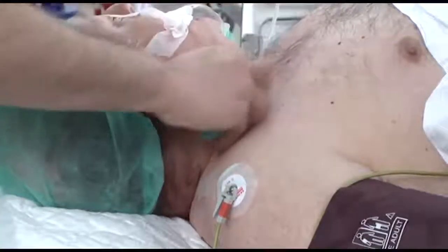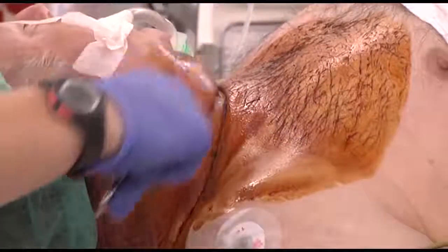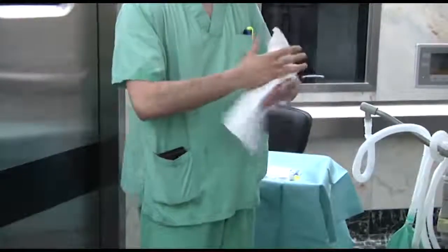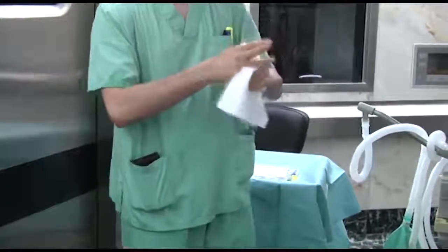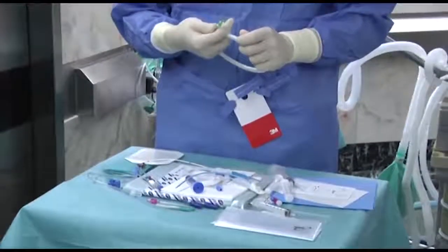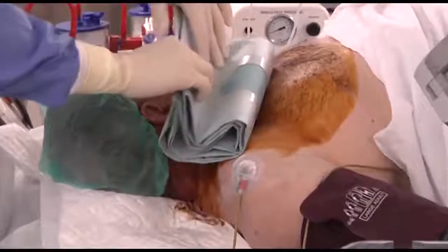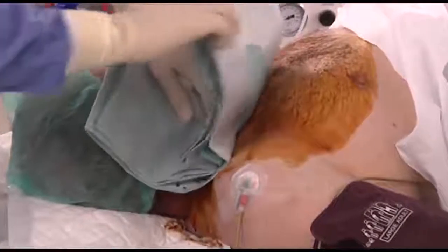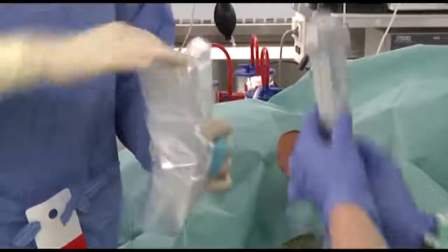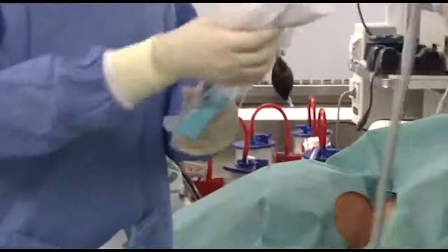After removing the remnants of gel, the skin is prepared with an antiseptic solution. The cannulator prepares the material and surgical field using an aseptic technique. The ultrasound transducer is then covered using a sterile sheath to avoid contaminating the surgical field.